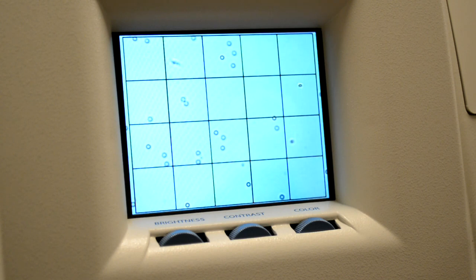This, of course, requires you to prepare the slide correctly, as stated before, with 10 microliters of sample, on a 1 inch by 3 inch slide, and a 22 by 22 millimeter cover slip.